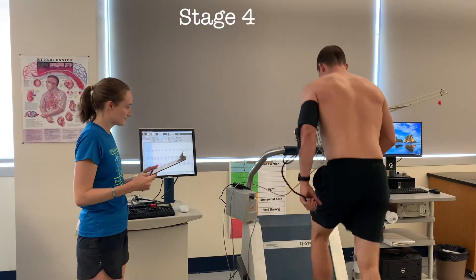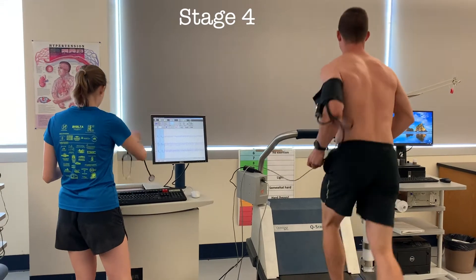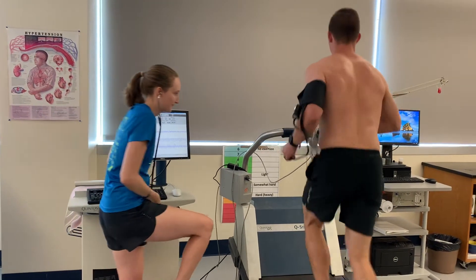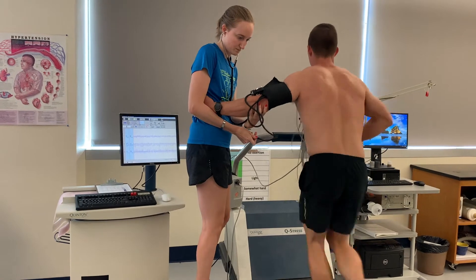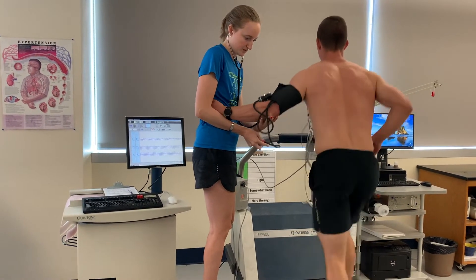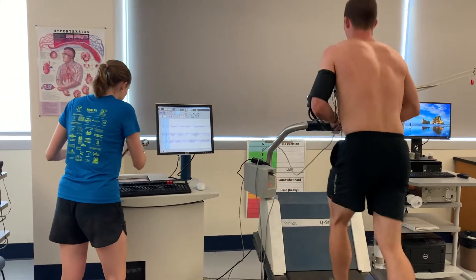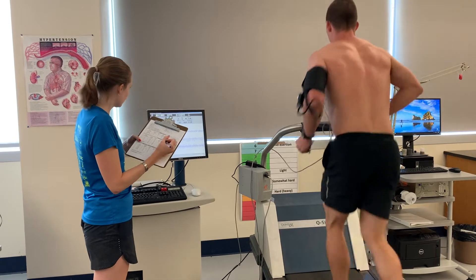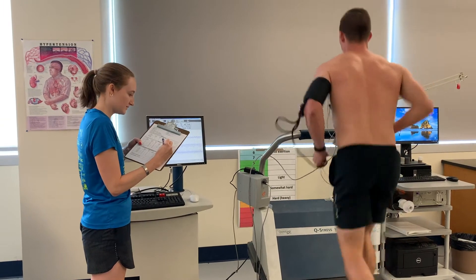Nice job. Start striding it out. We're two minutes into the stage, I'm going to take a blood pressure. Got 174 over 86. Doing really good. Heart rate is 156. How's your RPE? Probably 15. Awesome, doing great.